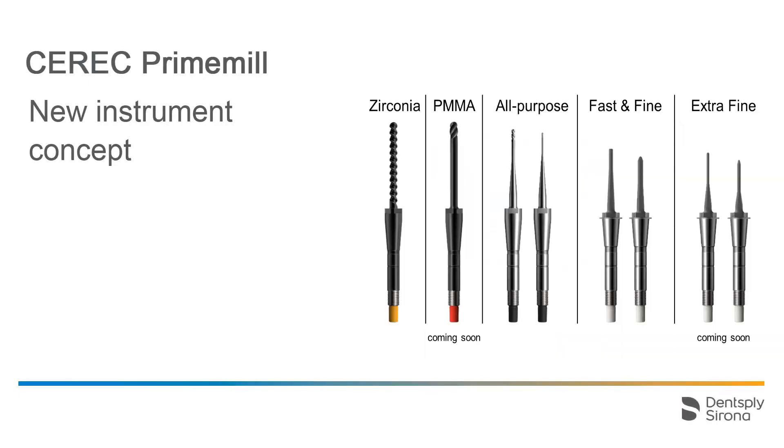Finally, we will turn our attention to the new instruments of the CEREC PrimeMill. To help with the choice of the appropriate instrument, they are color-coded based on the material to be processed and the processing mode. The instruments coated with white are diamond-coated grinders of varying diameters, used for wet grinding. The yellow-coated instrument is used both for wet and dry milling of zirconium oxide. The instrument with red coating is only used for processing PMMA blocks, and will be available at a later time. The black-coated instruments are available with diameters of 1.0 and 0.5, and are used for wet or dry milling of different materials. The extra fine instruments will also be available at a later time.